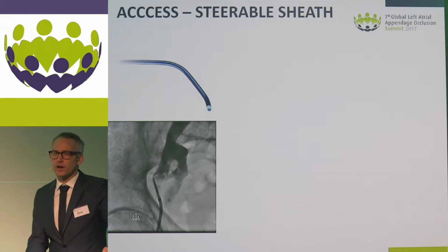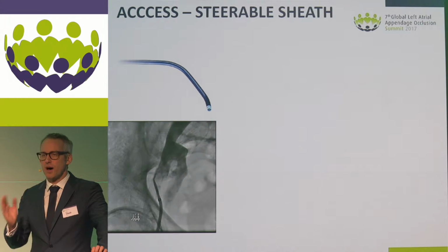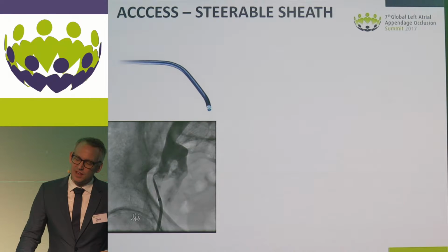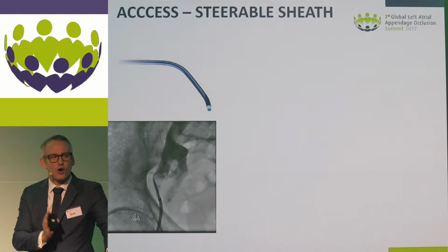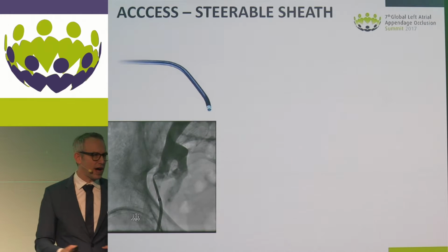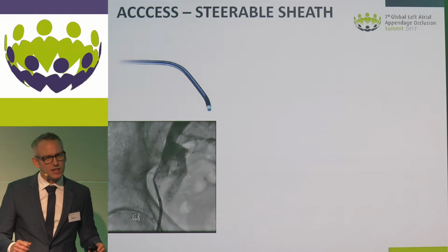A little earlier in the procedure is the venous access. And as I said, most of my problems during the procedures is to bring this sheath up. Because a lot of our patients have tortuous venous anatomies with kinking, and the double curved sheath sometimes is very difficult to manipulate through these curves and then to get it across the septum. So one possibility in this scenario is to use a very stiff guide wire, like an Amplatzer extra stiff or ultra stiff, in order to straighten the anatomy and to give you more support to bring up the sheath.